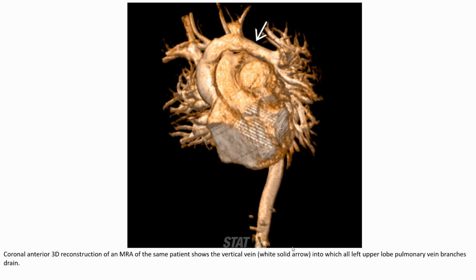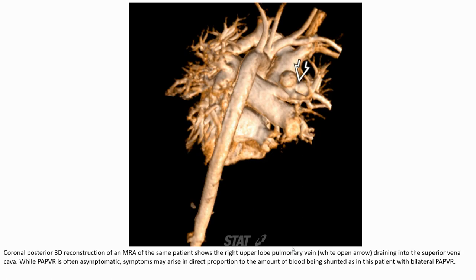Coronal anterior 3D reconstruction of PAPVR shows the vertical vein into which the left upper lobe pulmonary vein branches drain. Coronal posterior 3D reconstruction of PAPVR shows right heart chamber and pulmonary vein draining into the superior vena cava. While PAPVR is often asymptomatic, symptoms may arise in direct proportion to the amount of blood being shunted, as in patients with bilateral PAPVR.